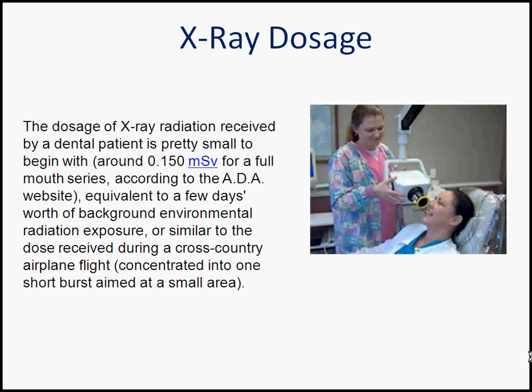X-ray dosage. The dosage of X-ray radiation received by a dental patient is actually pretty small to begin with, around 0.150 mSv for a full mouth series according to the ADA, equivalent really to a few days worth of background environmental radiation exposure, or similar to the dose received during a cross-country airplane flight, concentrated into one short burst aimed at a small area.